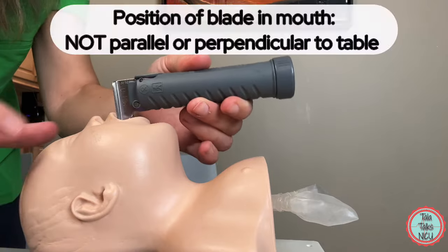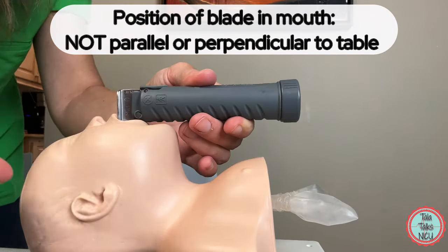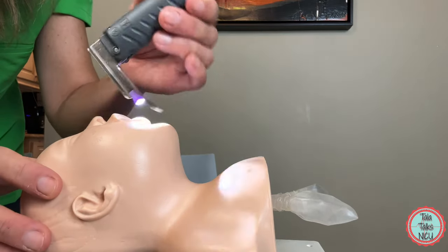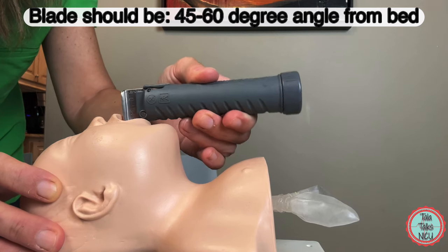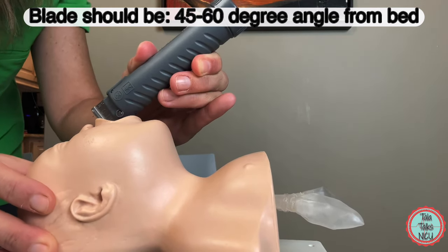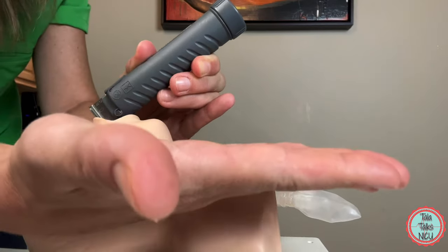Once you have the blade inside the baby's mouth, you don't want it completely flat with the bed — that's zero degrees. You also don't want it at 90 degrees. Really, you want it somewhere around 60 degrees with the bed. So you're at quite an angle from the bed.